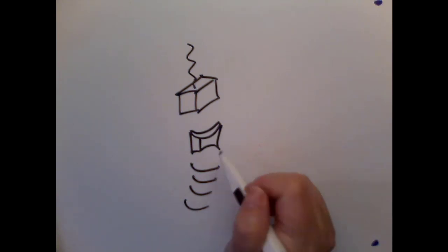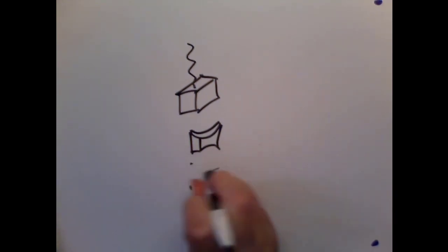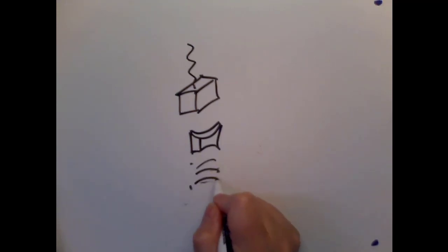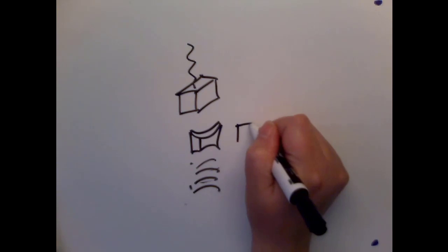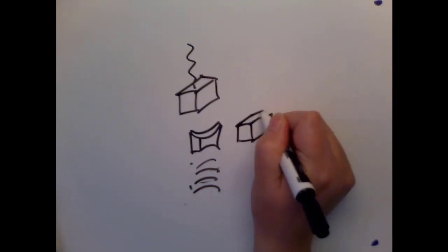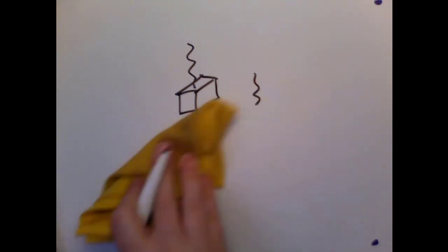And then the reverse is true. When we have our sound coming back, the sound wave comes back from it. This is already deformed. It's going to kind of pop back the other way, and then electricity will come out of that. So piezoelectric materials deform when they interact with electricity and pressure waves.